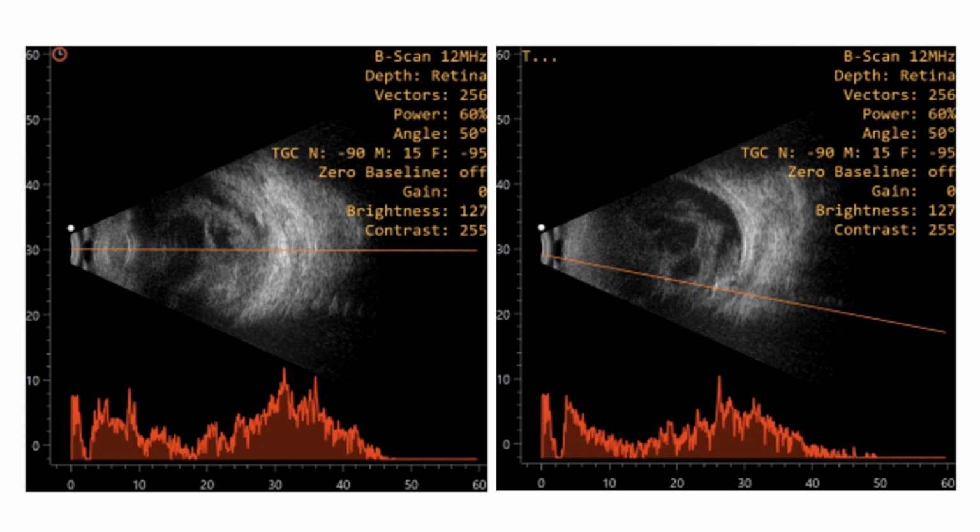In the presence of so many vitreous echoes, how will you confirm the presence of a foreign body? Ma'am, if there's a hyper reflective echo, if there's a presence of back shadowing. Yeah. So now the vitreous is full of echoes and you are not able to locate the foreign body. You should reduce the gain so that all these vitreous echoes will become less. Then you will be able to pick up the foreign body.